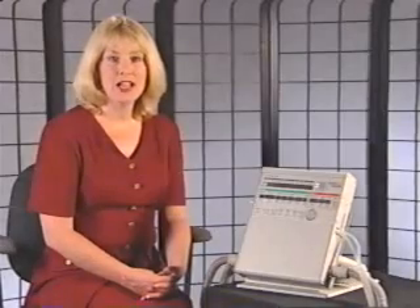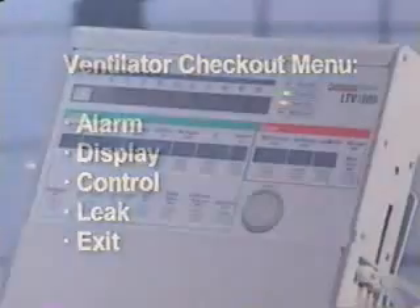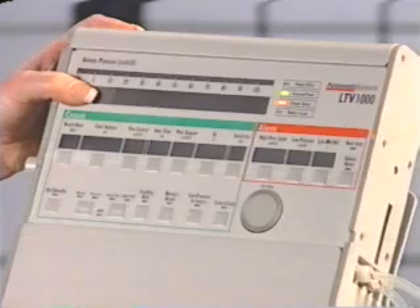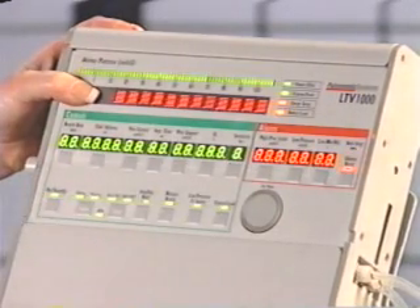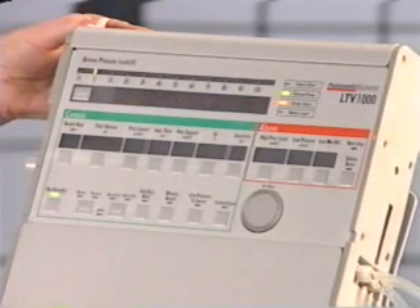A ventilator checkout should be performed to verify that the ventilator is working properly before using it on a patient. You must disconnect the patient from the ventilator and power the LTV down prior to performing a ventilator check. The ventilator does not deliver gas during the ventilator checkout. The ventilator checkout menu is set up as follows: alarm, display, control, leak, and exit. In order to access the ventilator checkout menu, press and hold the select button, and then press the on/standby button. Keep holding the select button until the POST test is complete. POST stands for power on self test.